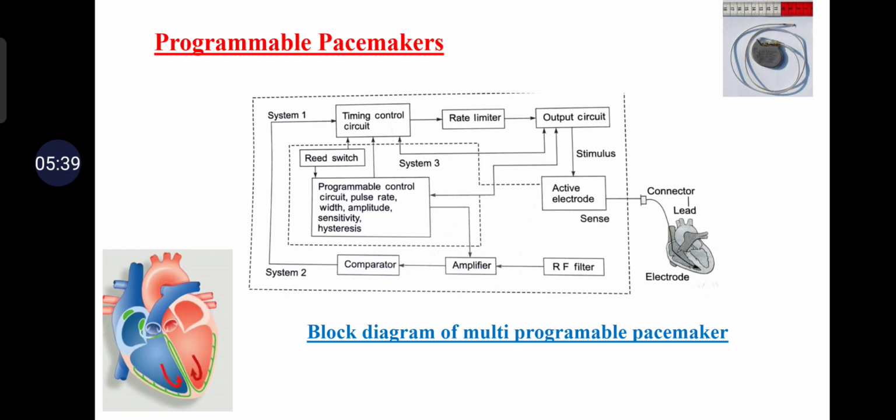Only when all these checks are satisfied is the programmable control circuit directed to store the new code. By activating the appropriate electronic switches, the programmable control circuit directs the system to implement the new program conditions. So the pulse generator is non-invasively programmable by means of a programmer, which emits the magnetic code that enables the following parameters to be altered.